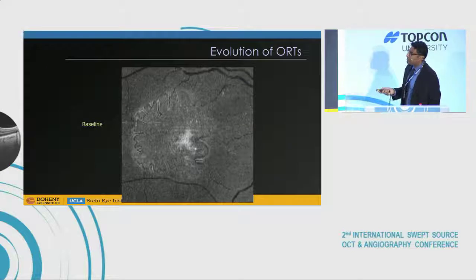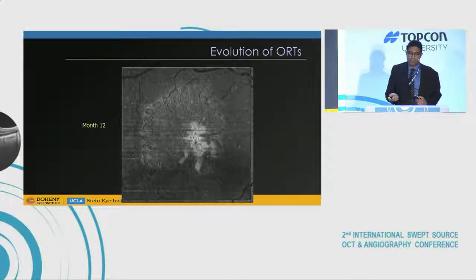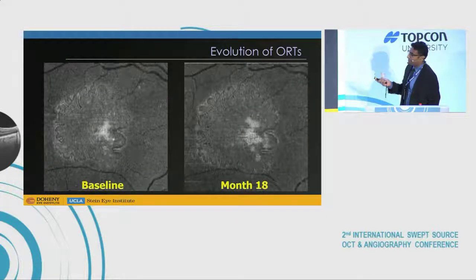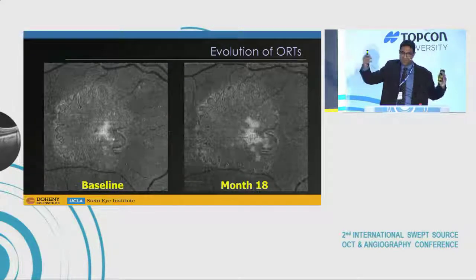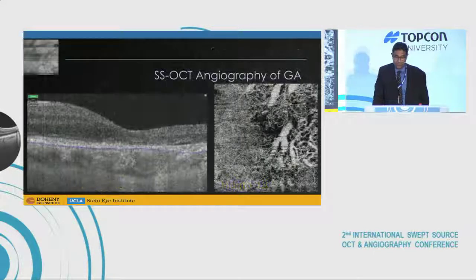And we've been very interested in tracking the evolution of these using en face OCT. It's interesting as you track these along, they always connect back to the edge, but there is a dieback over time. I've always viewed these as conduits that are trying to keep the photoreceptors at the very edge alive, but obviously you can only do that so long. Once the conduit gets long enough, I think you're over the cliff.